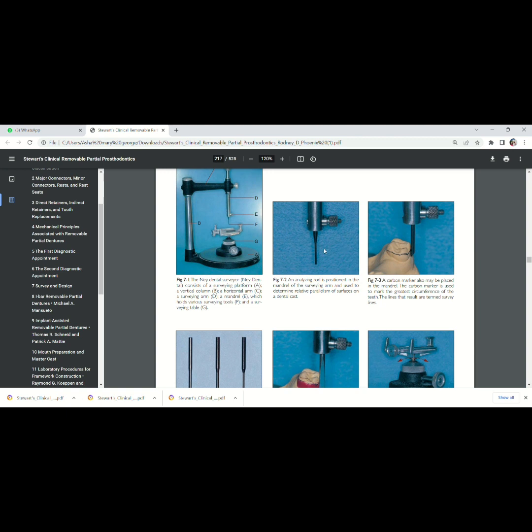Now we will come to different types of surveying tools. The first one is the analyzing rod. The analyzing rod can be attached to the surveying arm to locate the undercut.